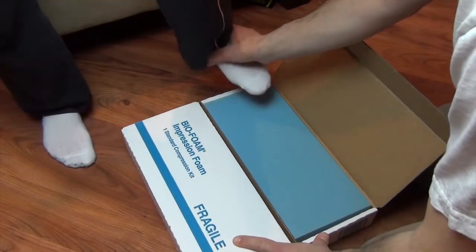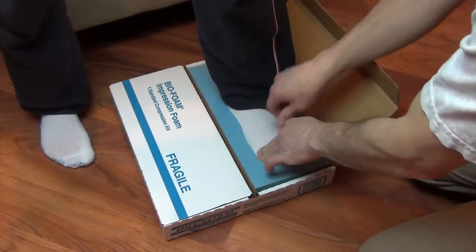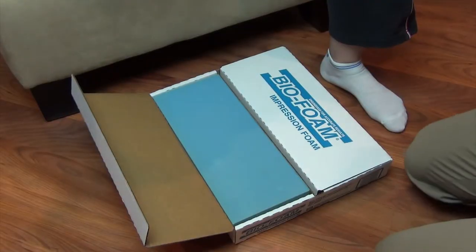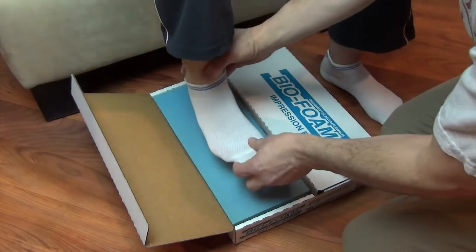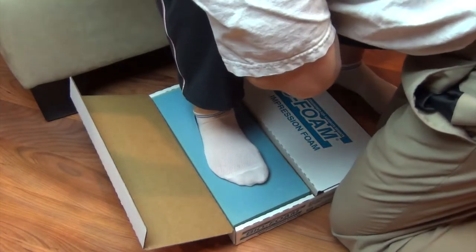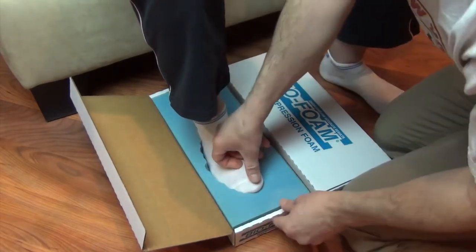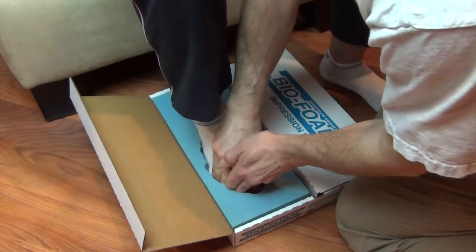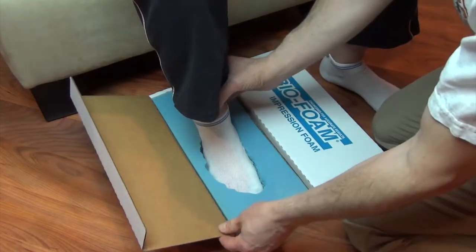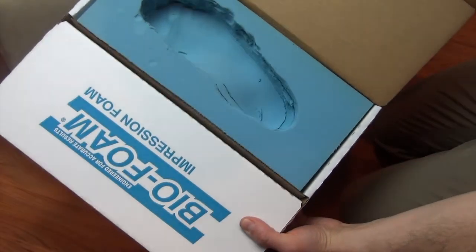I'm going to show you first how to do this weight bearing — this is the way I do not do it. I have this individual put all their weight down on their foot: heel, forefoot, arch, everything goes down. Now let me show you how I do it with the arch up. I have the leg lined up straight with the foot and I simply push down on the knee, which pushes the heel all the way down to the floor. Then I push down on the outside of the foot getting that outside ray down, push down on the big toe and the lesser toes, and lastly I put my thumb on the big knuckle bone and push the ball of the foot all the way down to the floor. When I take the foot out of the mold, look how high the arch is — the arch never went down in the mold. The arch is all the way up. That's key.